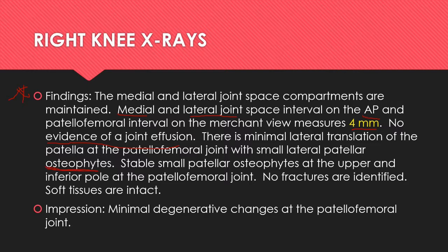So now we're starting to see some clinical findings come together, where the MRI, the physical exam, and now the diagnostic x-rays are starting to paint a picture of patellofemoral involvement. And this is turning into less and less of a knee joint proper case and more of a patellofemoral case. There are small, stable patellar osteophytes at the upper and inferior pole of the patellofemoral joint. No fractures, soft tissues are intact.